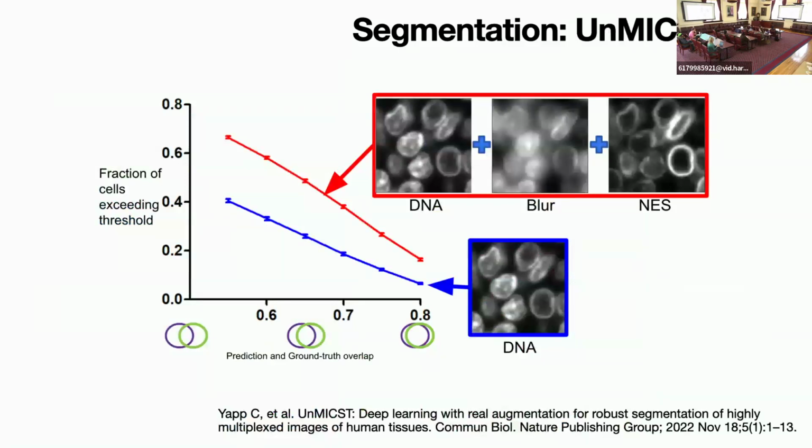The one thing I want to just give a shout out to Clarence, the thing that he realized is that the classic augmentation method of adding more synthetic data to your data set when you're training a segmentation algorithm, which is to blur the images so that you simulate data that's actually out of focus a little bit, so you can sort of recover slightly out of focus signals.